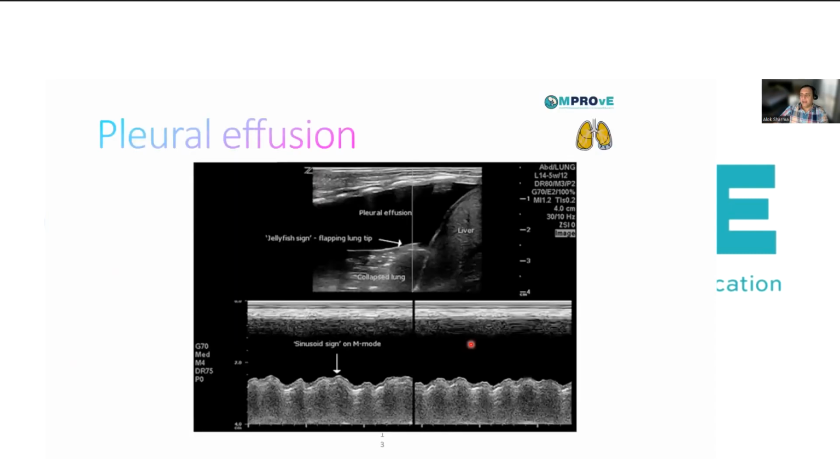Now, I think as a basic approach, most of us, when we do our lung ultrasounds, tend to use, I would say, longitudinal ultrasound, which is ultrasound, if you look at me, perpendicular to the chest. And we would do it in all the zones. You'd do a comprehensive ultrasound. But the other methodology is what we call transverse ultrasound, which is basically done in each intercostal space.